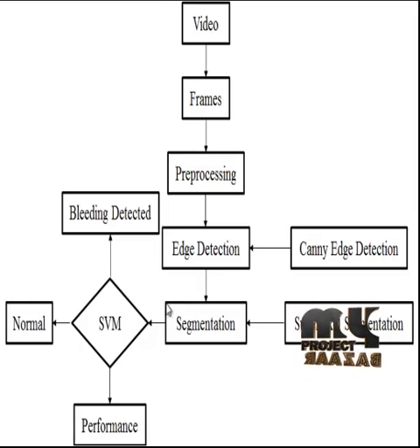After that, classification is employed using the support vector machine classification. In the support vector machine, we extracted feature values from the regions, based on statistical parameters estimated from the video frames, and these were given as the input for the support vector machine classification.